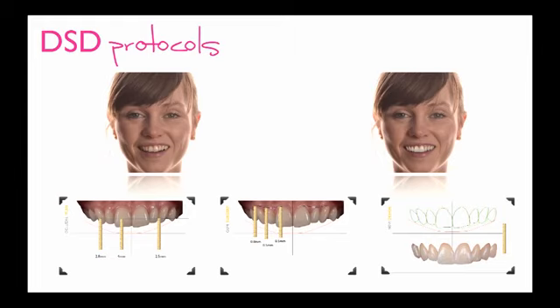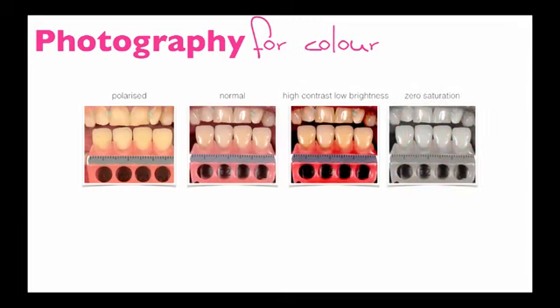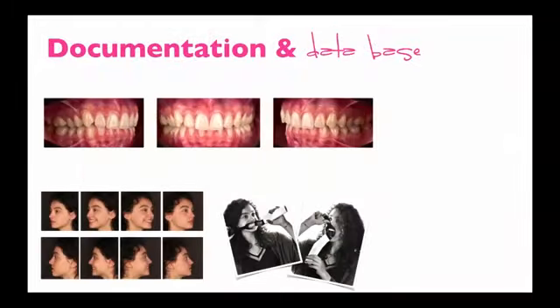Then the next thing, we need good dental photography, even if it's intraoral, for DSD planning, because everybody knows it's the best communication tool between the dentist, technician, and the patient. So we need good photography for this. Nowadays, we go more and more for digital workflows, but still, photography is used for that. Photography for color, because many dentists work with technicians that are not so close to them. Then we need photography for color, for shade taking. And usually during my courses, I'm teaching this protocol. It's extremely easy, and everybody can do it.